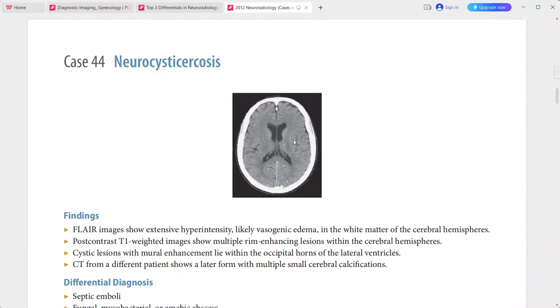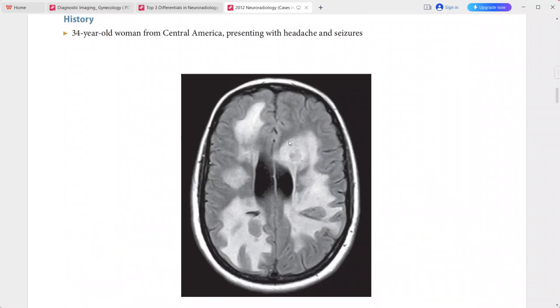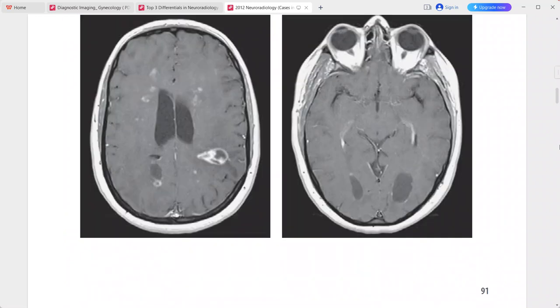A CT from a different patient demonstrates multiple small cerebral calcifications, which can also be present in this condition. This is a case of neurocysticercosis. Differentials include septic emboli, fungal/mycobacterial/amoebic abscesses, metastatic tumors, and tumefactive demyelination.